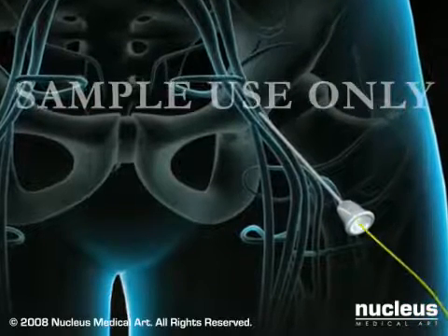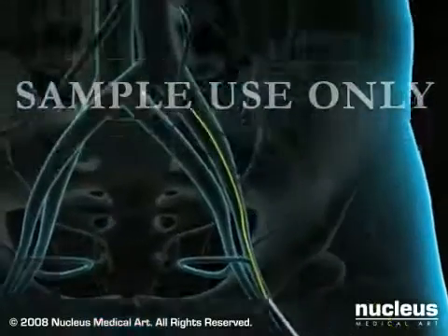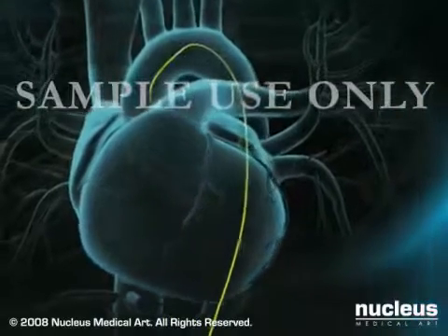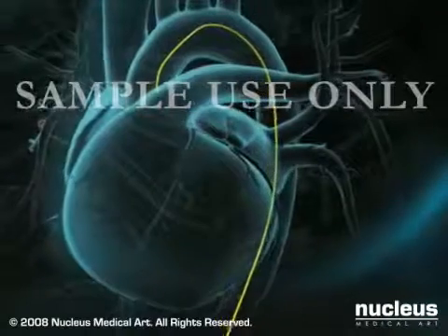Once the needle is placed, a guide wire is passed through the needle and gently guided through the arterial system to the heart. The needle will be withdrawn and exchanged for a small, flexible tube called a sheath, permitting access to your femoral artery.